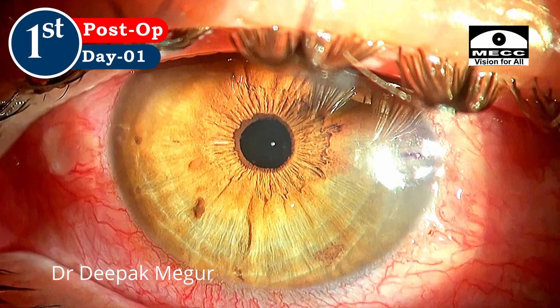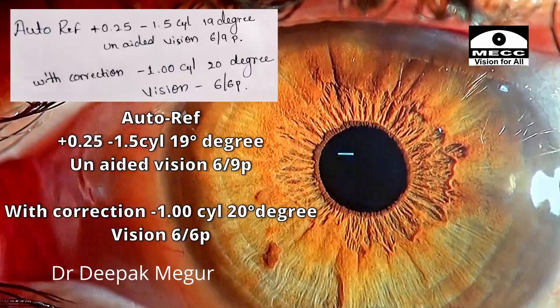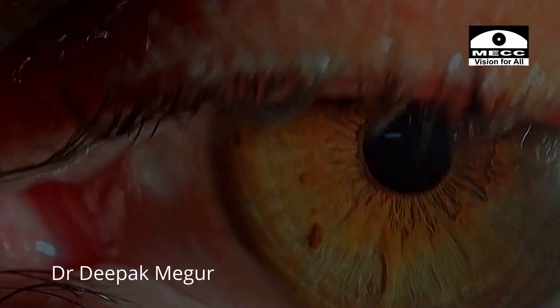This is the first day picture with the refraction, and this is a picture at 10 days. The patient has a residual refraction of 1.5 diopters but reads 6/6 with a 1-diopter cylindrical correction.